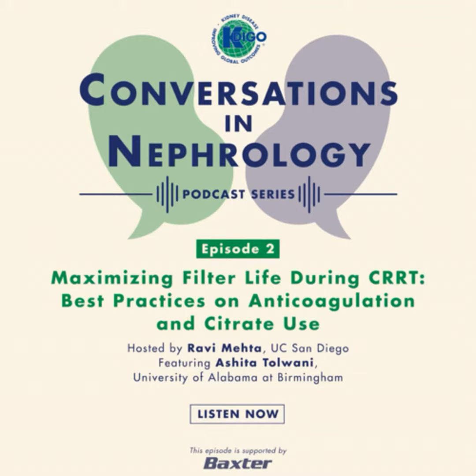When you give RCA, it could be delivered as a fixed ratio between the blood and citrate infusions or titrated based on ionized calcium levels. Many of the CRRT machines these days have RCA software that allows for safer and easier delivery of the RCA, but unfortunately it's not available everywhere, including the United States. Given that, it's really important to know all the different components you have to think about when developing a citrate protocol. The first component, of course, is a citrate solution.